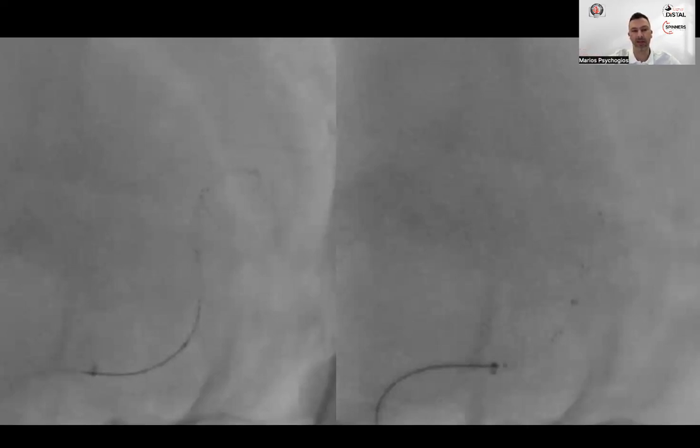So again, both things can be done. I find it easier for somebody who starts on these occlusions to do it quadriaxially. It's safer. If you have experience, then it's no problem to do the exchange technique. You just have to be careful not to remove your stent retriever as you are exchanging the long microcatheter for the small 3 French aspiration catheter.